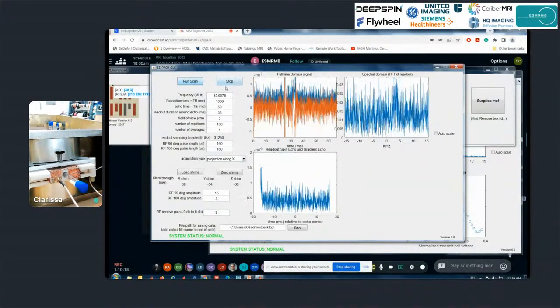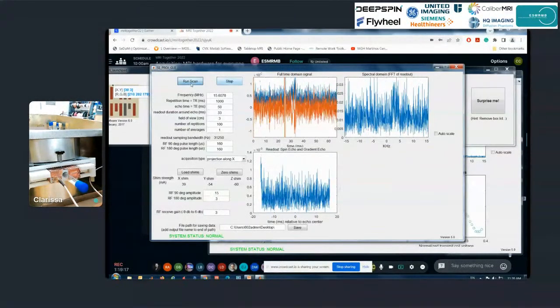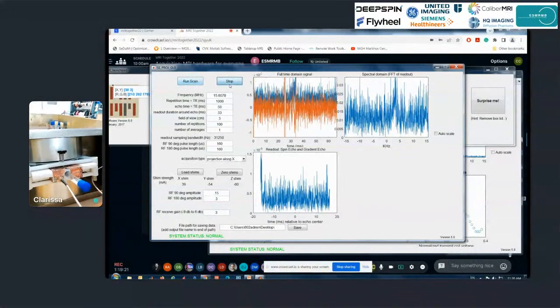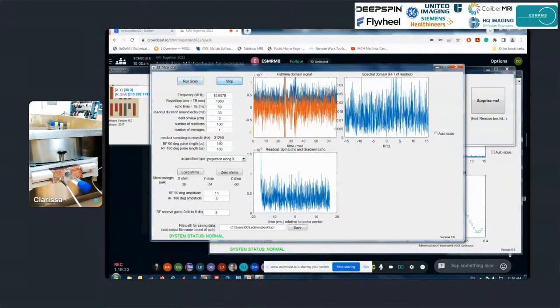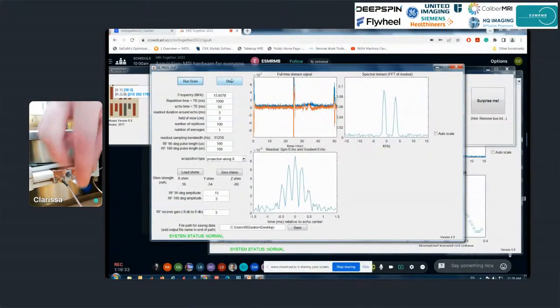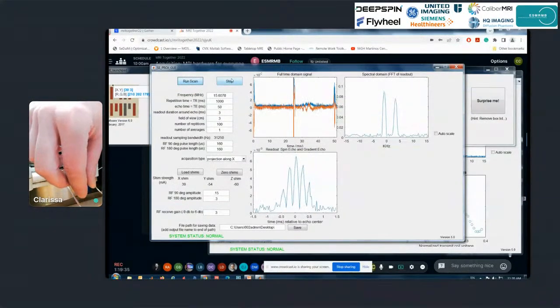Stop and start. Oh, the readout is too long. It's a 33 millisecond readout. Just make it like 3. There we go.